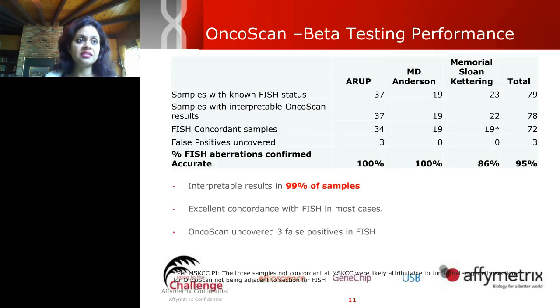What happened in these cases was, these were all HER2 cases, and as you know, oftentimes in FISH, what is measured is the ratio between the CEP17 probe in the centromere and the actual HER2 gene. And when the centromere has a deletion, that can skew the ratio and make the HER2 look like a relative gain, even if it's normal.